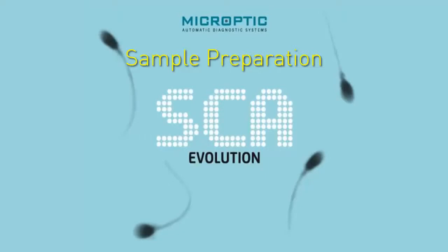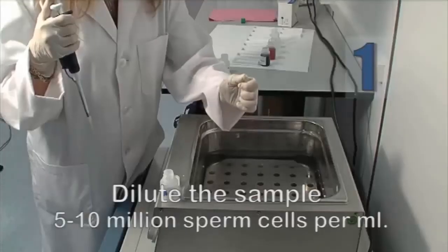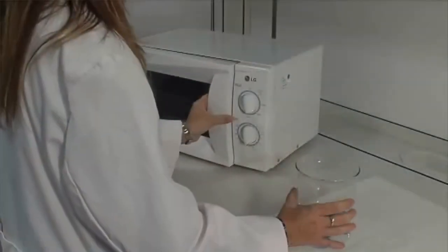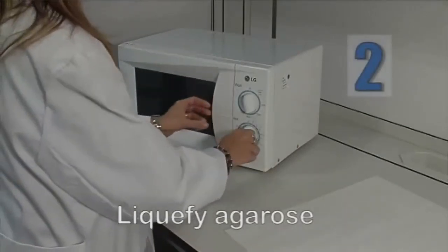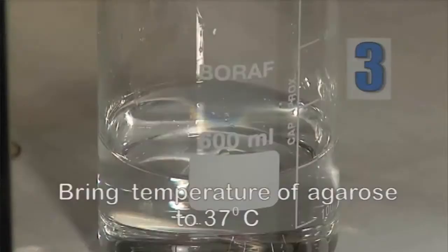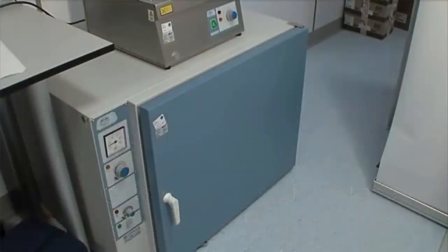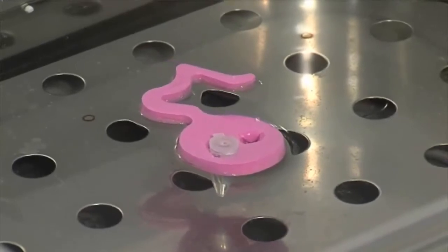DNA fragmentation sample preparation. Dilute the semen sample between 5 and 10 million sperm cells per milliliter in PBS or diluting agent with low protein content. Heat the Eppendorf tubes in the microwave for 2 minutes at maximum power to liquefy the agarose. Alternatively, place the tubes in a water bath with boiling water during 5 minutes. Transfer the tubes to an incubator or water bath at 37 degrees centigrade during 5 minutes to avoid producing heat shock when introducing the sperm cells into the agarose matrix.